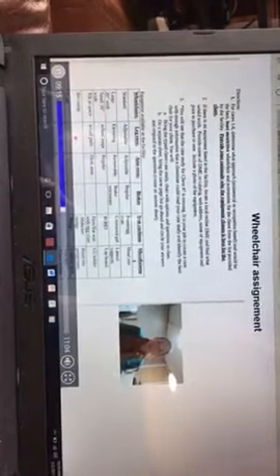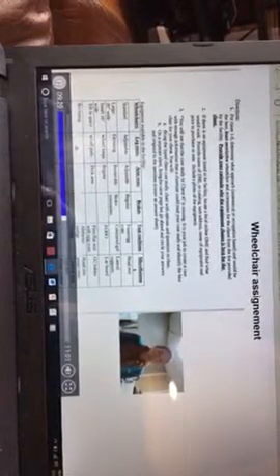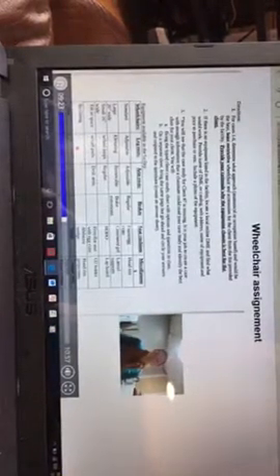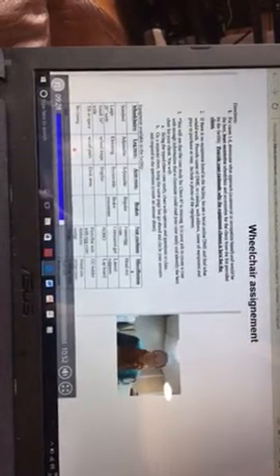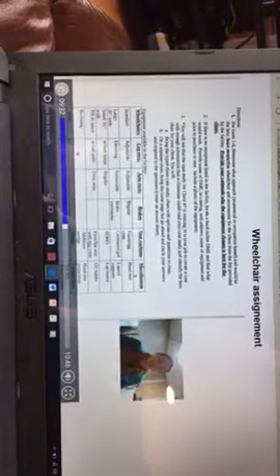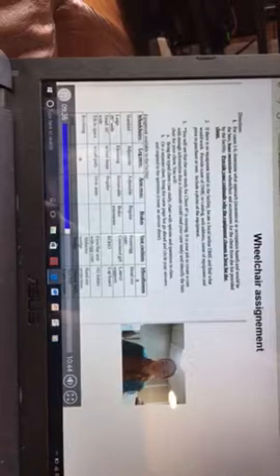The abductor wedge is important if you have somebody who has hip precautions, but they tend to want to cross their legs, that can help. If you have somebody who wants to slide forward in their chair and get a little posterior pelvic tilt and start sliding forward, that abductor wedge will pop them back up into place and prevent them from sliding out.